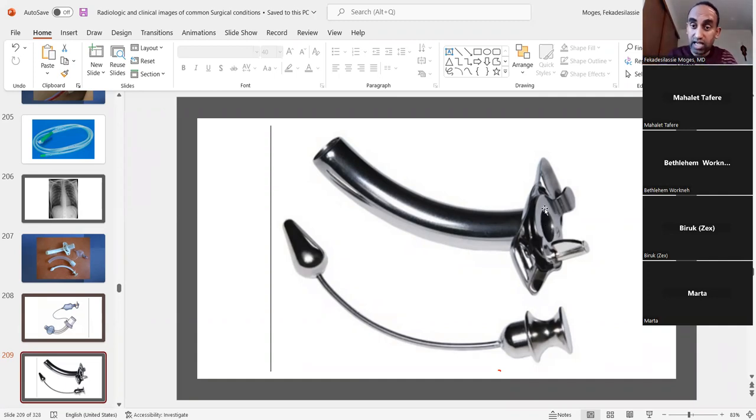If you pull it, it can come out. You see this holder? If I hold there and then pull it, this one is a lock. If I rotate the lock and hold it here and pull it, it comes out. This one is the inner tube. It's already assembled. The obturator comes and goes in here, which is inside the inner tube, all right?